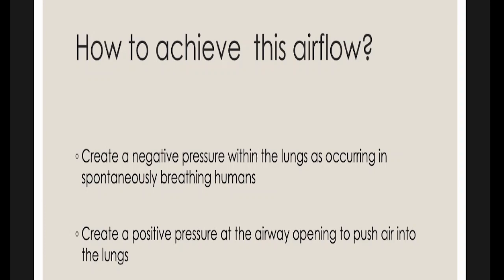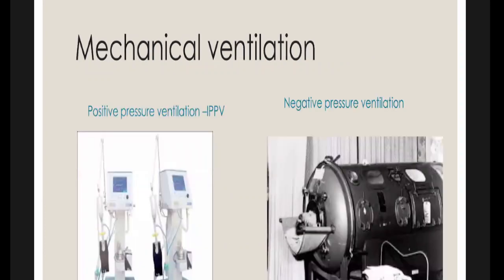Okay, right. You all would have already seen different types of ventilators in our ICU, in the theater setups, everywhere, right? On your left-hand side is a conventional ventilator. You have a screen, or an interface, where we feed in our numbers, and then you have the tubing system which delivers the gases to the patient.